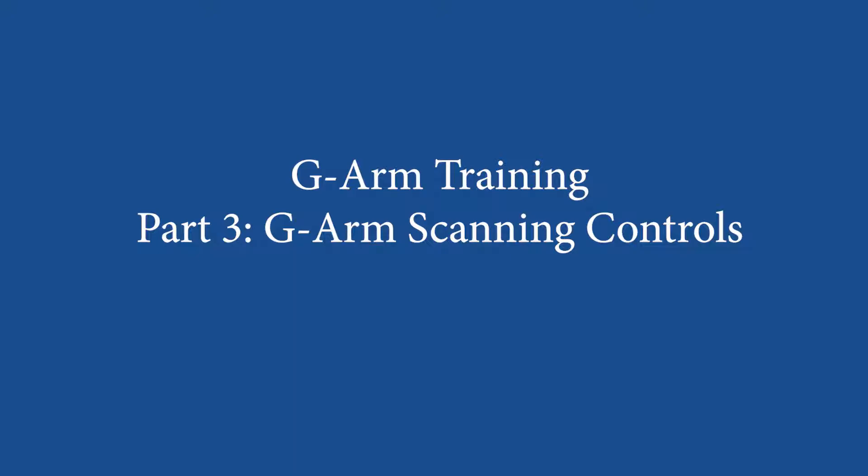Welcome back to the third video in this series where we will explore the G-ARM scanning unit. You may recall our first two videos showed setup and operation of the console. Now we'll be looking at the remote control and movement capabilities of the G-ARM B6 Duo.